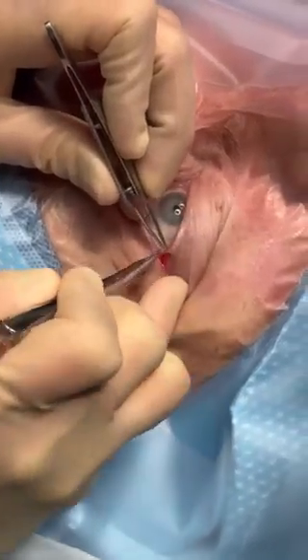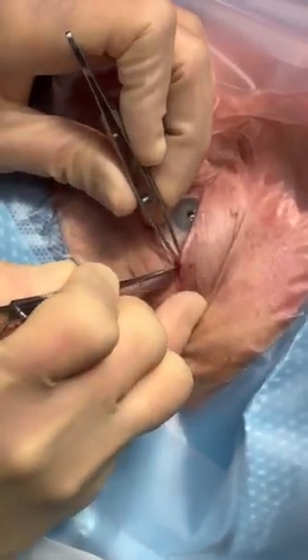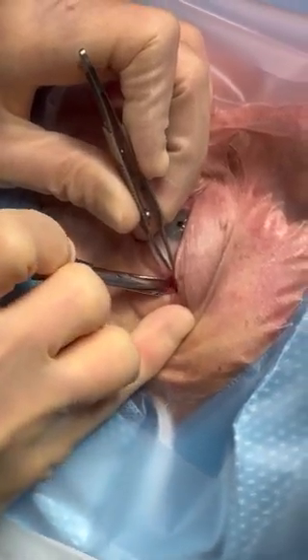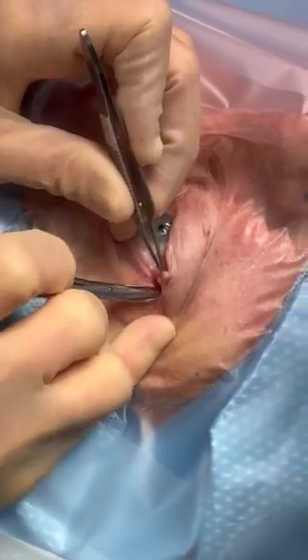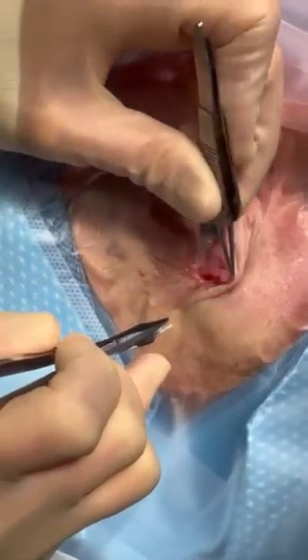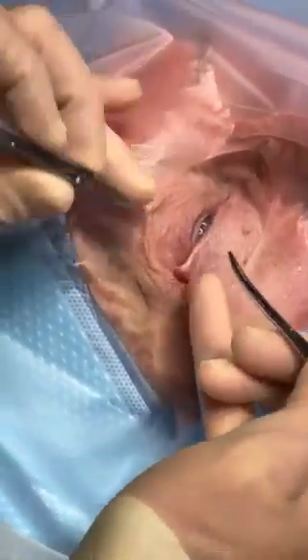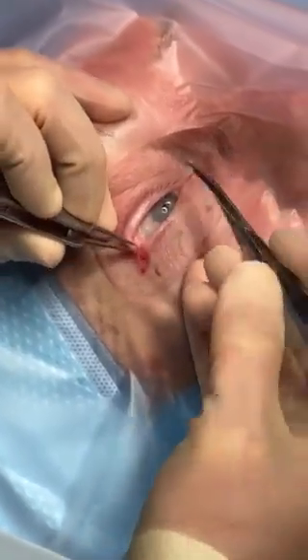Right inside the skin, if you pick up on the lid margin, there's a tight attachment of the inferior crus low over the periosteum that can be incised. You can note that the lid is now freely movable. This will release tension in the orbit and give space for arterial inflow and outflow.